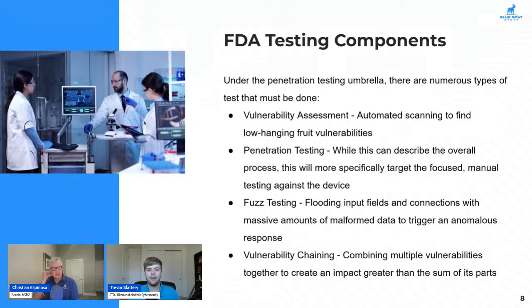The next thing that we look at is fuzz testing. Fuzz testing is something required by the FDA. And what it can essentially be thought of is throwing a massive amount of junk data at different input fields or different connections to see if it'll respond in a strange way. This can be just sending different length strings starting from 1 up to 100,000 into a single input field and seeing if it eventually crashes to indicate there's a memory problem, or sending malformed data into a certain interface to see if the application responds in a weird way or doesn't respond at all, or if it even ingests the bad data.